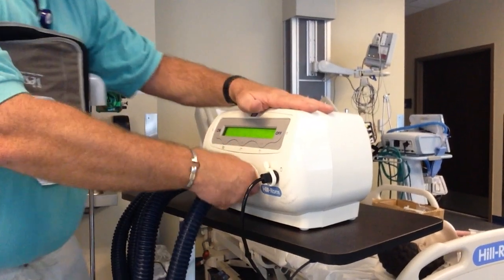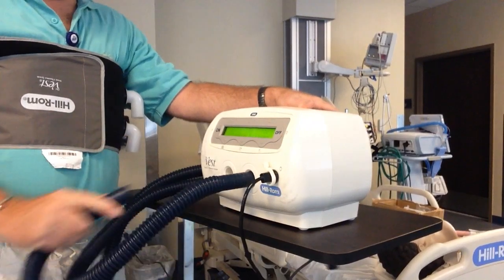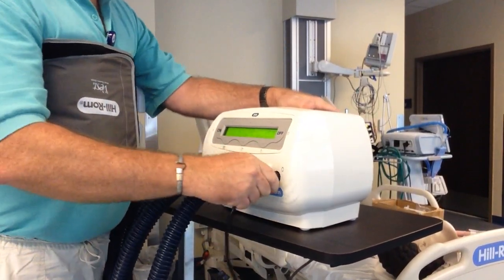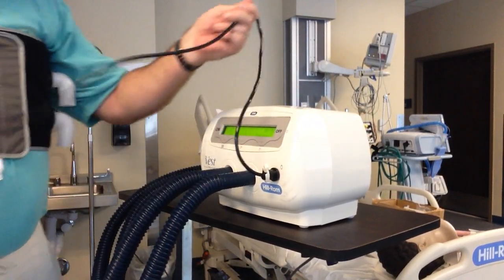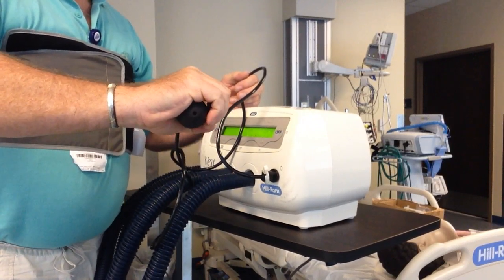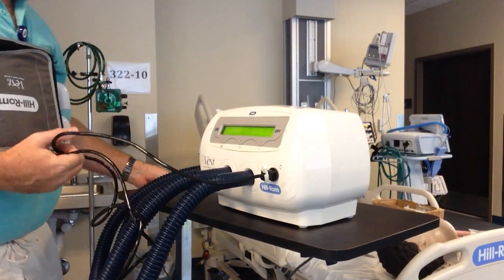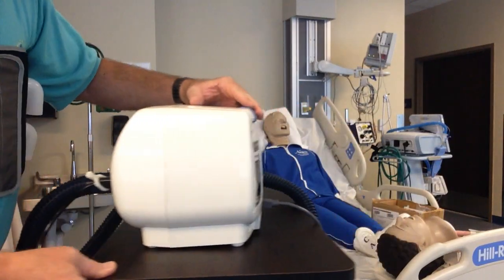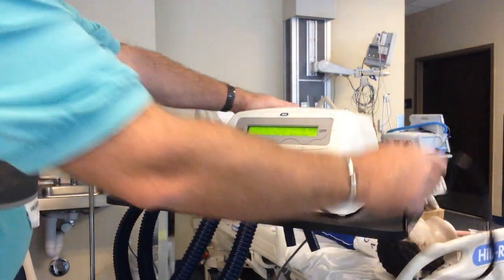you have two big blue hoses that connect to the front. There's not a right or left there. This black hose is a self-start, so you probably will not use it that much in the hospital, but it's just a bulb that will self-start and stop. This is so people can deliver treatments to themselves. This is really used a lot with cystic fibrosis patients. And you have the power cord in the back plugs up. That's all the connections that you really have.